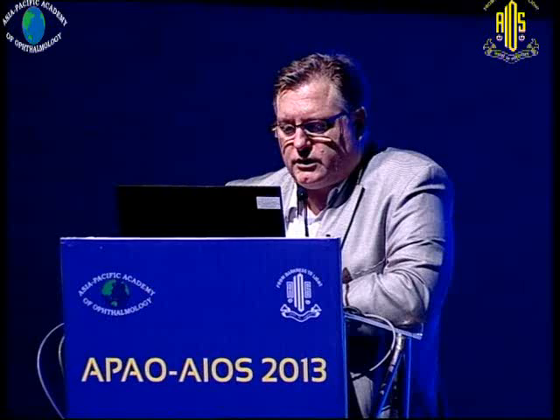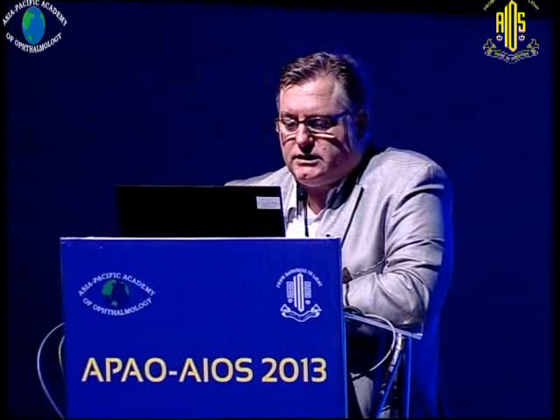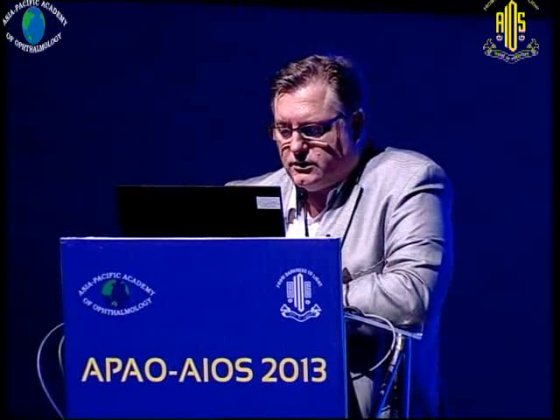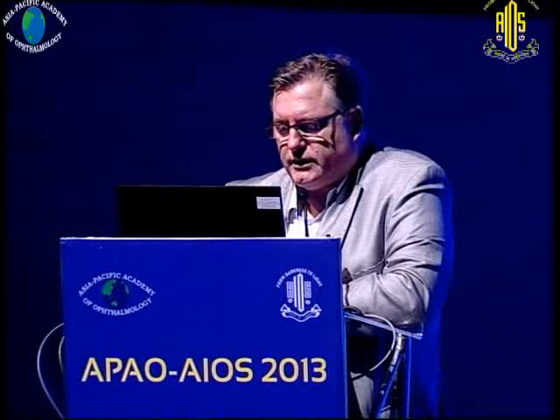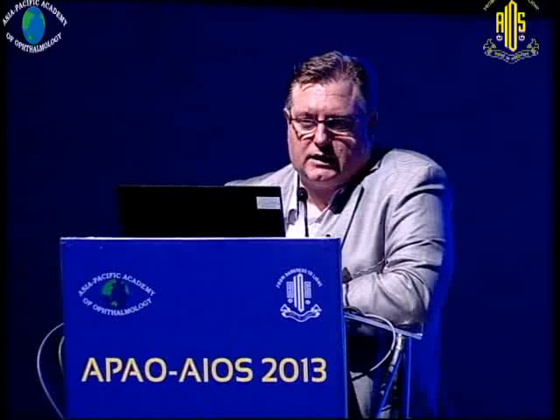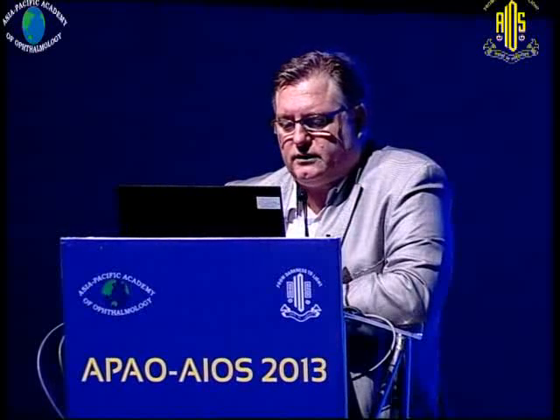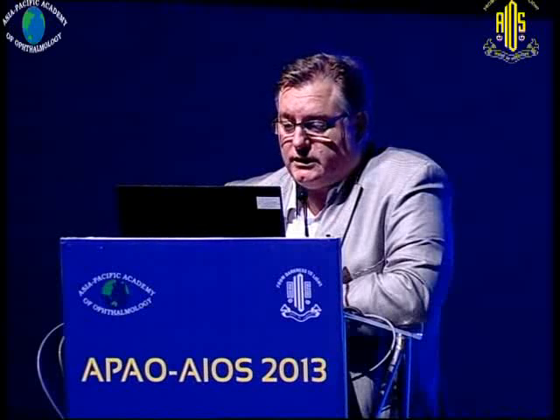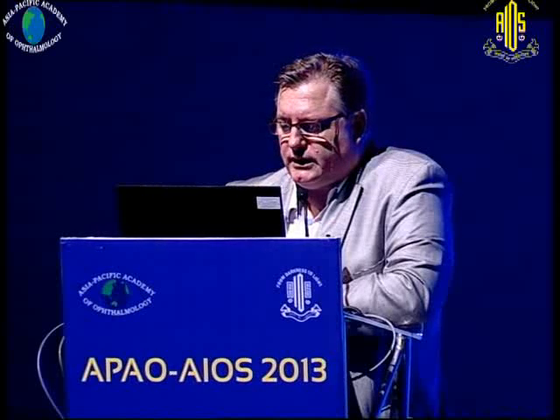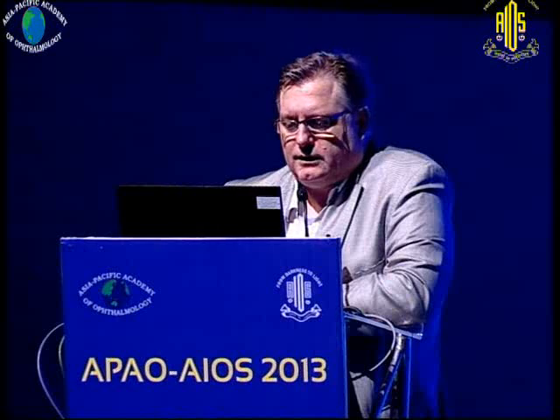If you look at the monocular or the binocular corrected distance visual acuity, you can see that 89% achieved the best corrected visual acuity of 1.0 and 100% even binocularly. 0% lost 2 lines after 6 months follow-up. There were some losers in the first couple of weeks, but this is more due to surgical problems or to dry eye symptoms. Uncorrected visual acuity was in 85% 0.8 or better, binocularly in 91% 0.8 or better. So patients have in general quite good distance and near acuity with this.